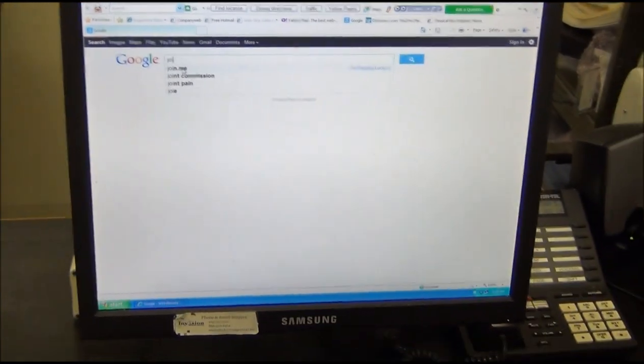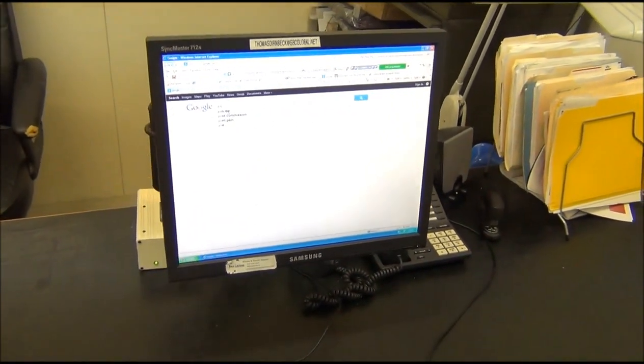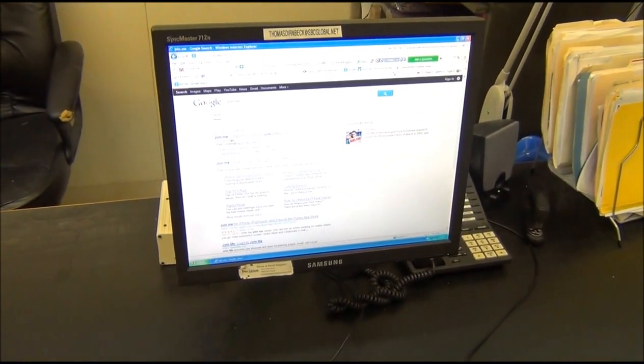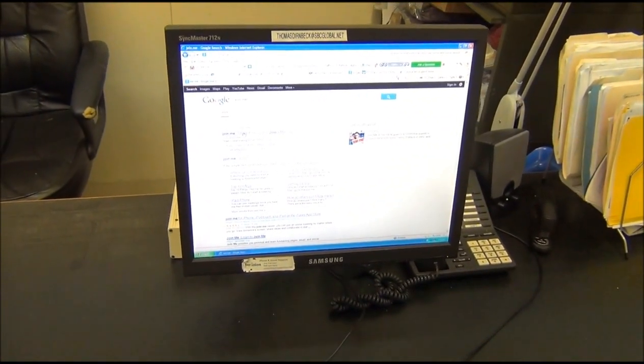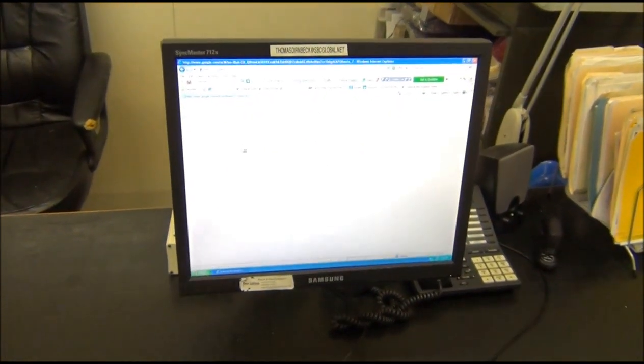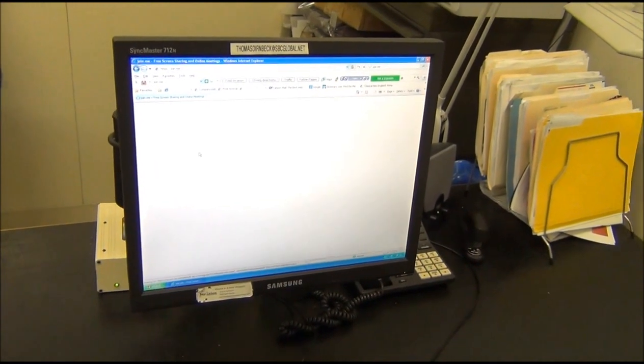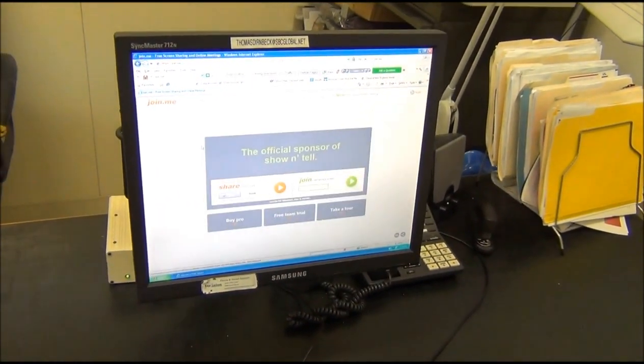That needs to be downloaded onto your speckFINDER system and then also onto the computer that's going to take control of speckFINDER. I'm sitting at Ann's desk, and Ann is going to download the Join Me software to her desktop. So Ann, go ahead and do that, please. Using her search engine, Google, she's just going to join.me.